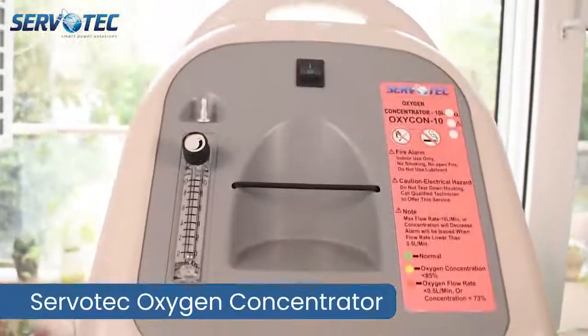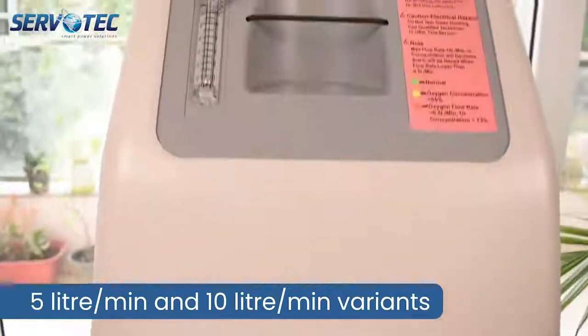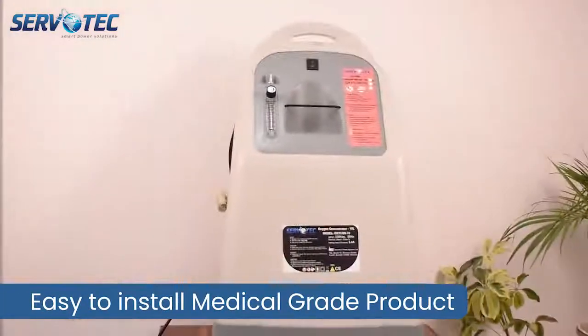Servotec Oxygen Concentrator. It comes in 5 litre per minute and 10 litre per minute capacity variants. This is the 10 litre per minute variant. It is a very easy to install medical grade product.